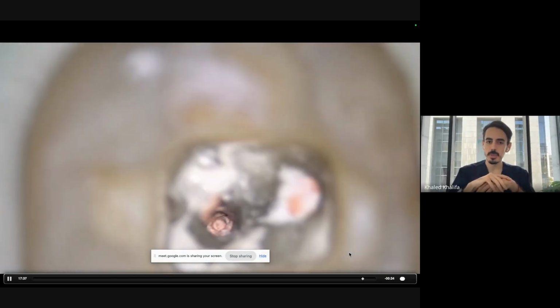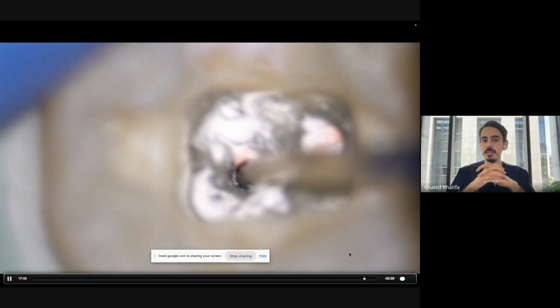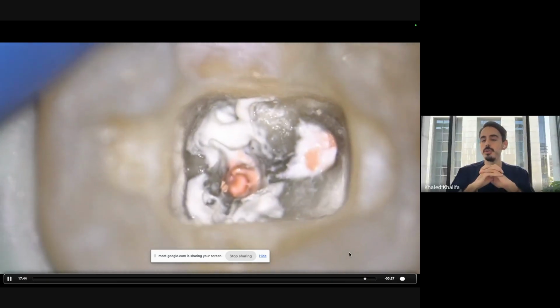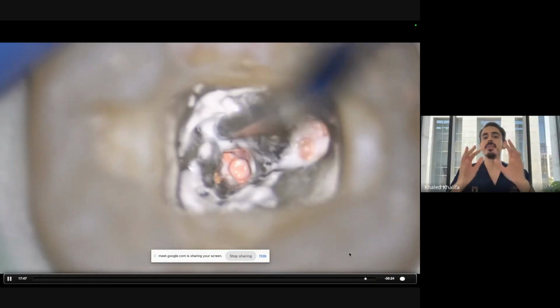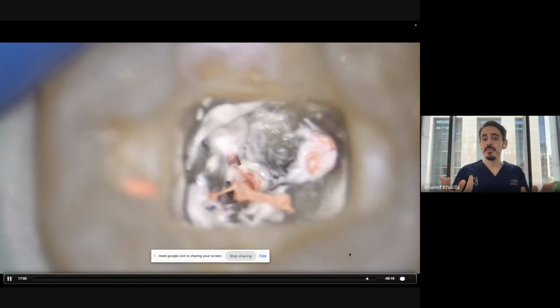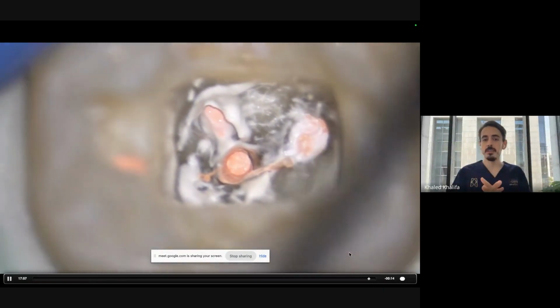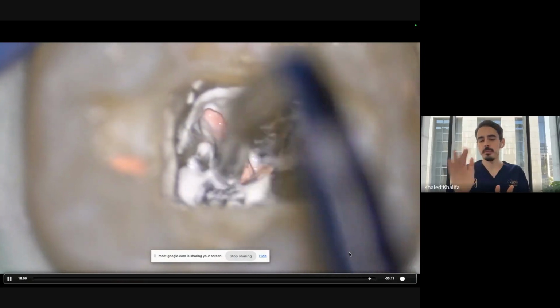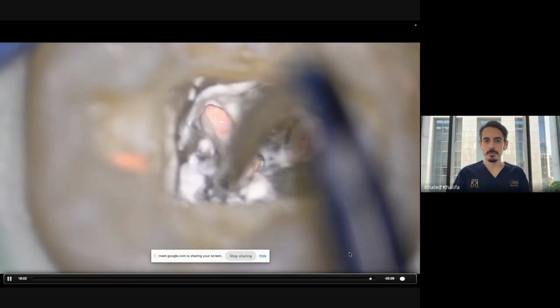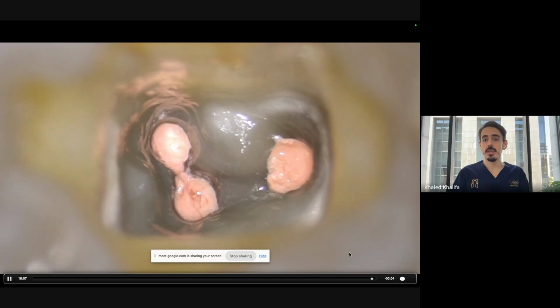And as I said before, we're gonna keep the heat carrier at maximum 150 degrees in order not to ruin our bioceramic sealer. Because even if the newer generation of bioceramic sealers are heat friendly, you still shouldn't increase the heat of the heat carrier device beyond 150, and maximum 180 degrees. And you should also keep the working time of the heat carrier device minimal. So this is the simplified workflow of endodontics.